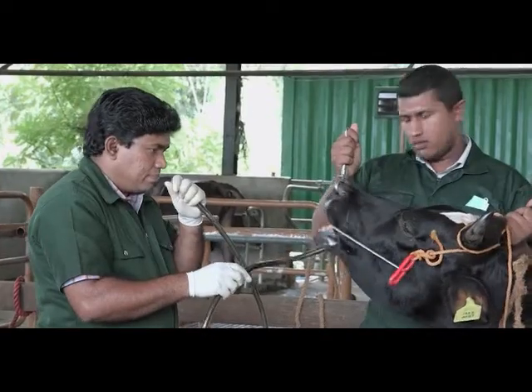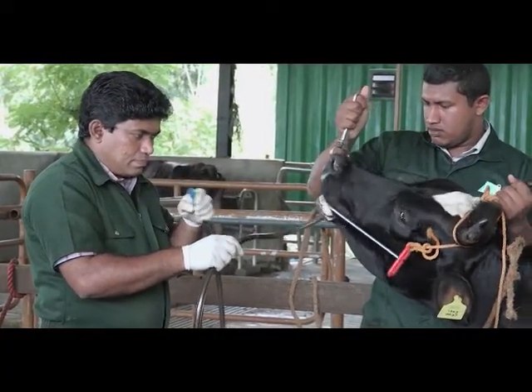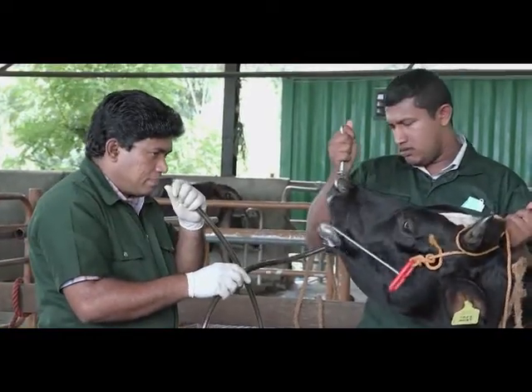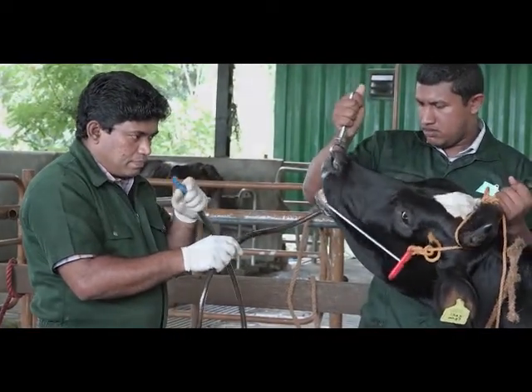Once the tube has reached the rumen, you can smell the rumen content. This is another way to verify that the tube has entered the rumen. Now you can administer the drug into the animal by fixing a funnel or a stomach pump to the stomach tube.